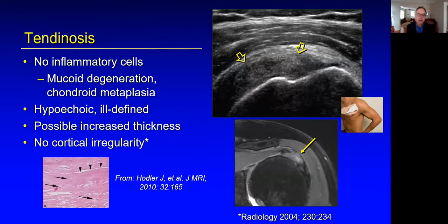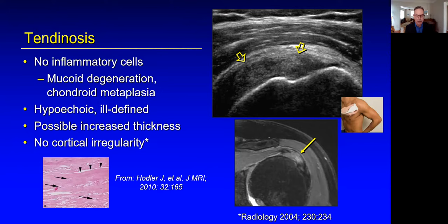Finally, tendinosis. The tendon will appear hypoechoic, but you can see it's more heterogeneous. You can't really define a defect. The indirect signs are missing — there's no cortical irregularity, no cartilage interface sign, and no volume loss or abnormal morphology.